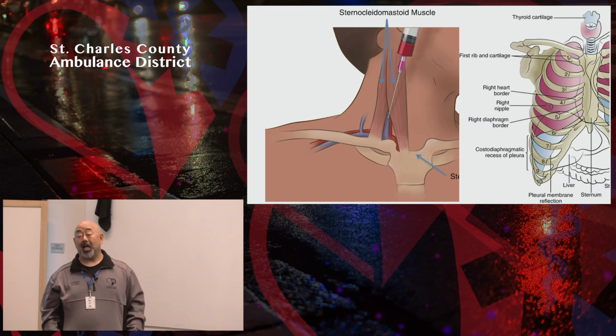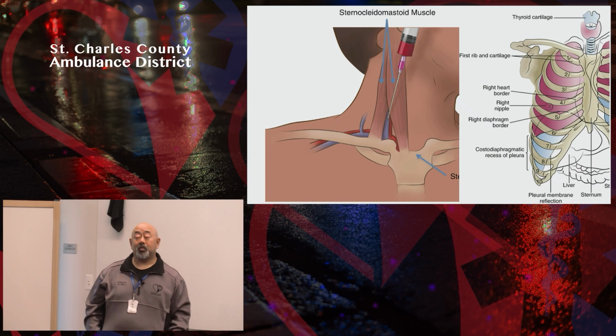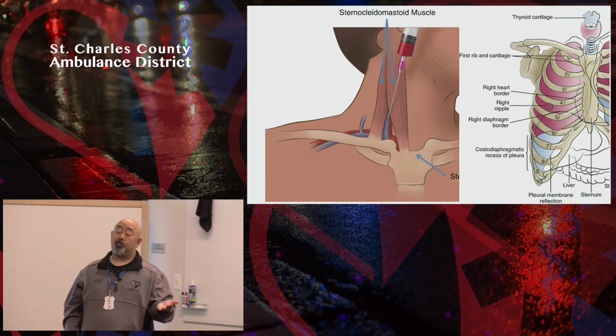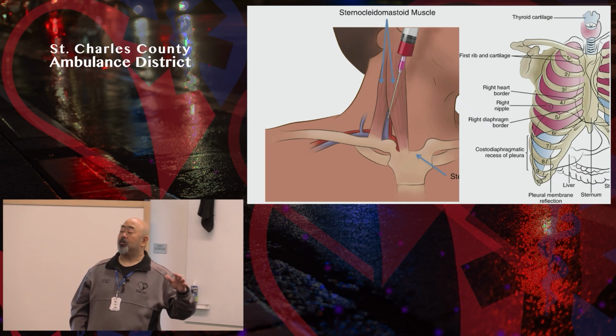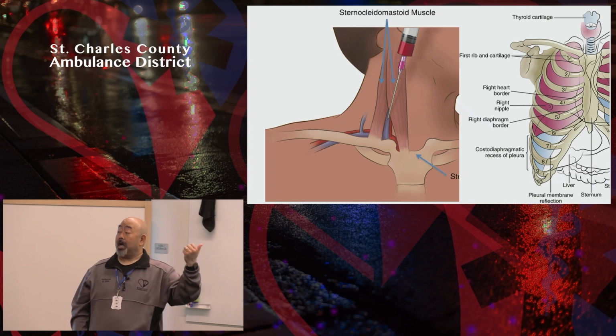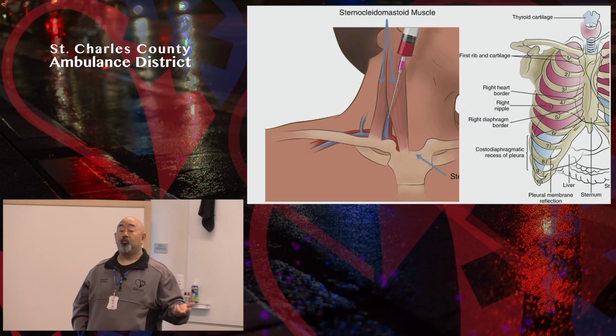Now, the thing to recall is that there's a lot of important structures when this is being placed. So one of the most important things for critical care paramedics to do when transporting a patient who just had a procedure, I don't care what the procedure is, but especially a transvenous pacemaker placement, you've got to know how it's done and therefore what the complications are, because the doctor who did the procedure may not realize the complication until you've left already, or the complication may not develop until you're on the road.